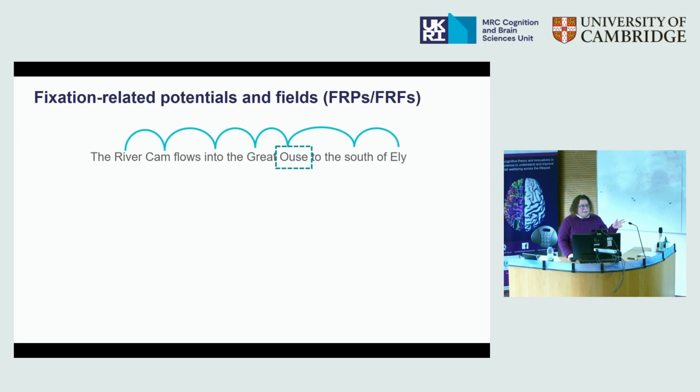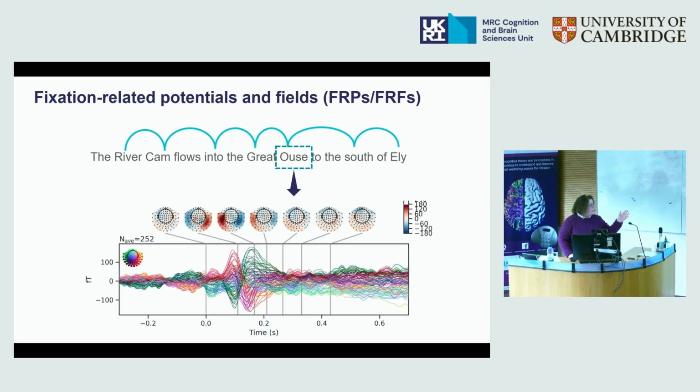And there might be a target word that we are interested in, and using information from the eye tracker, we can know exactly when they look at that word to generate fixation-related fields in this case. So this looks like a reasonably good visual evoked field. These are magnetometers. We see that there's a P1. There's still maybe some noise here due to saccades, and it gets a bit noisier as we go further down the epoch, but it looks like a traditional ERF.